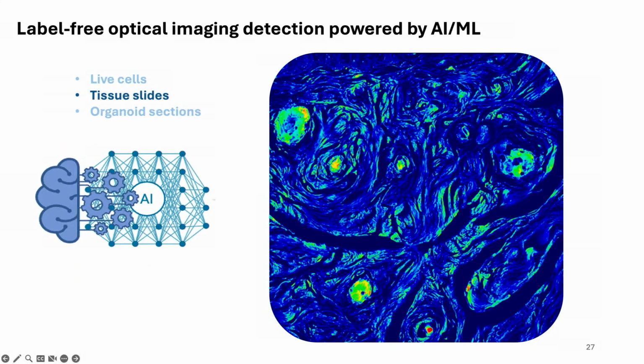The selected images were captured using our label-free imaging system. The blue and green colors you see are generated by our AI analysis, in which the color gradient shows the intrinsic optical properties of the tissue, such as intracellular mass density and the structural organization of the fallopian tube. We hope this AI label-free imaging platform can accelerate doctors' and pathologists' screening time and narrow down the focus region to find STIC earlier and quickly.